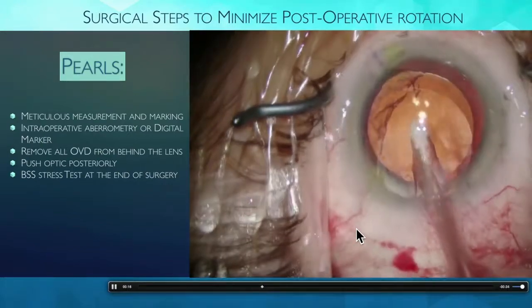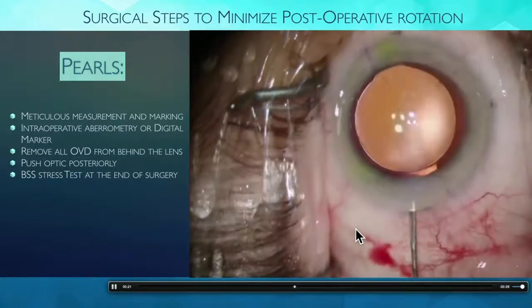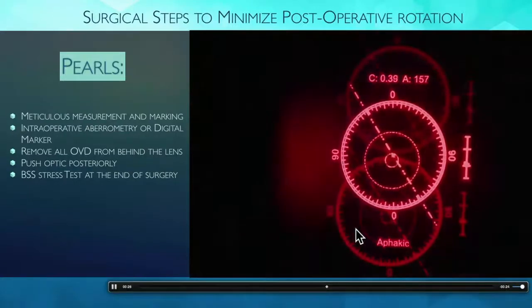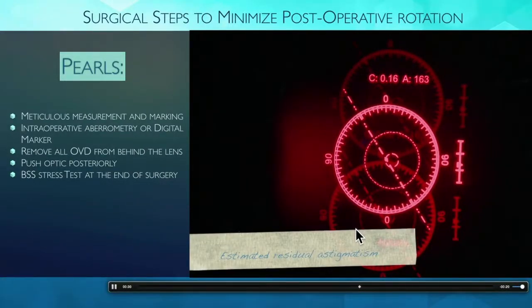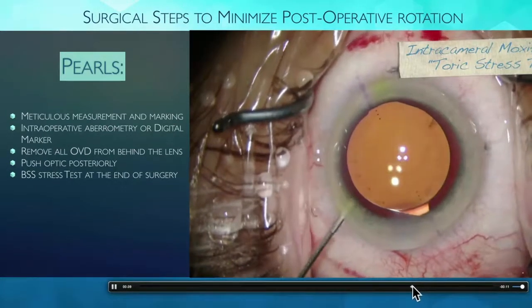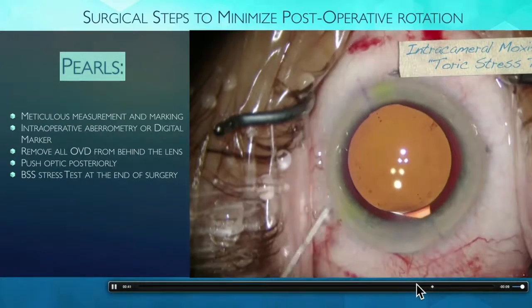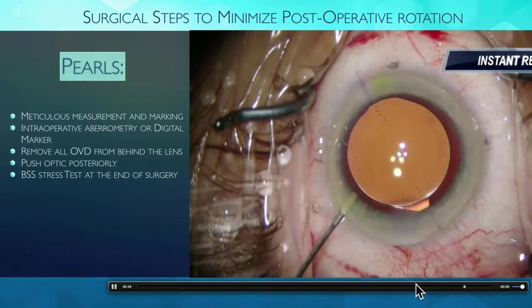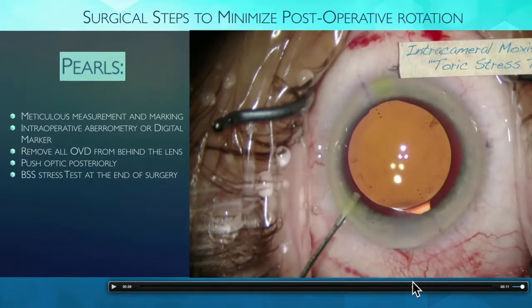And then the one final pearl, and I think this has been mentioned over the years, but I want to re-emphasize this. Right at the end of the case, go ahead and put a little flush of BSS or your intracamerals in. If you see a little flush of the BSS go in and the lens wiggles a little bit, you can feel confident that you need to reposition. So here's my intracameral stress test. We're going to go in and put like a big flush in, make sure that cannula is on really tight, and then we can make sure that we have no rotation of that lens. Better to do it with BSS than intracamerals, because you want the intracameral to be the last thing that you put in the eye.